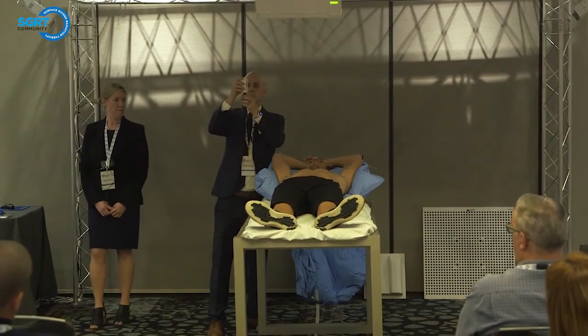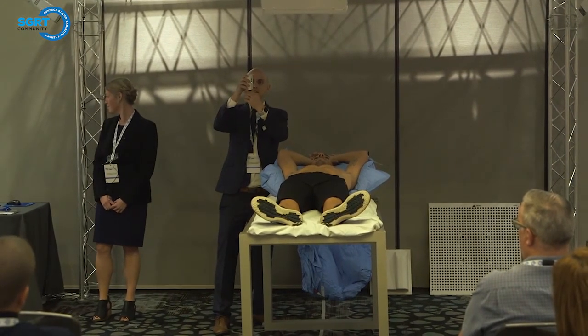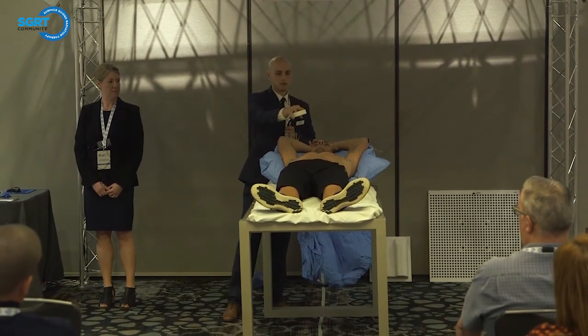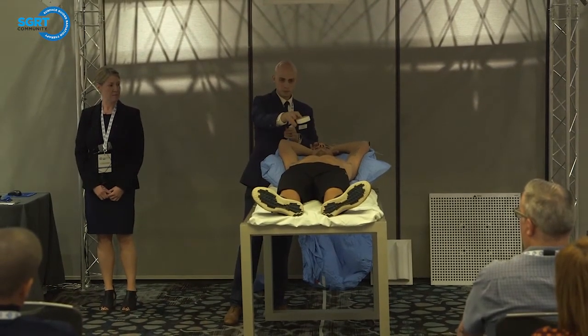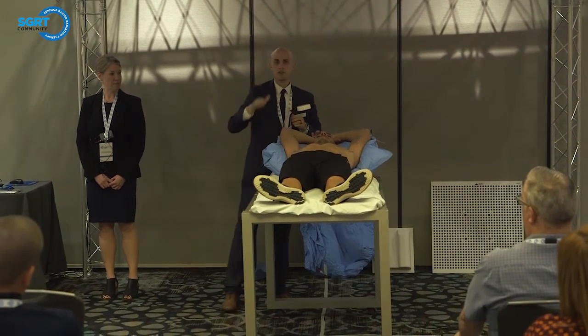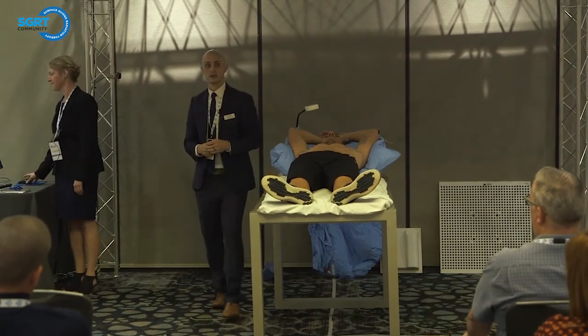And then you just attach it by screwing on the couch as so. And once that is attached, you can label it or bring it over to the patient for them to look at. Okay, and then that patient knows exactly how much breath they need to take in to assume the same position that they achieved in the simulation.